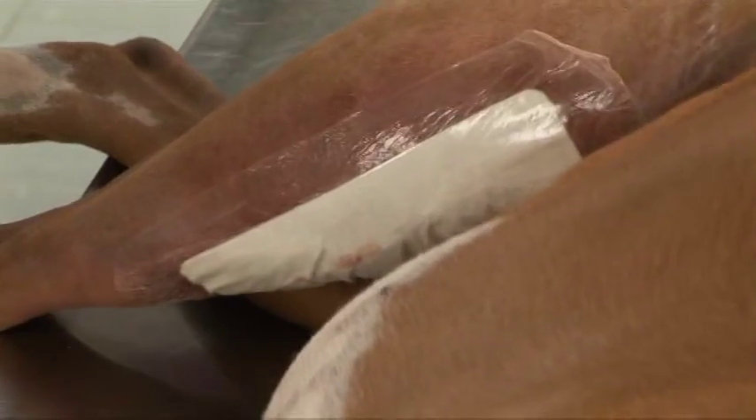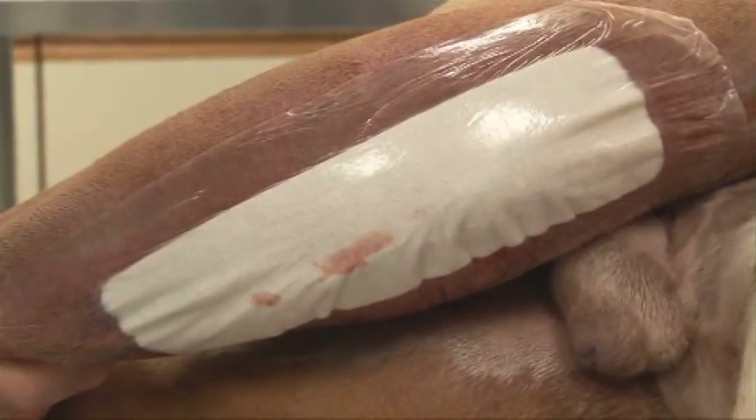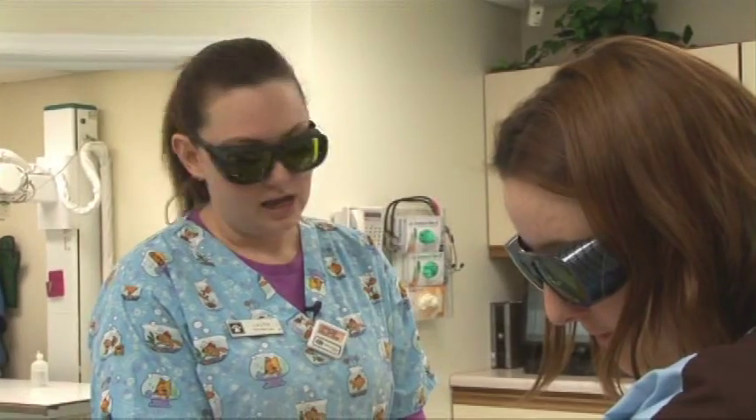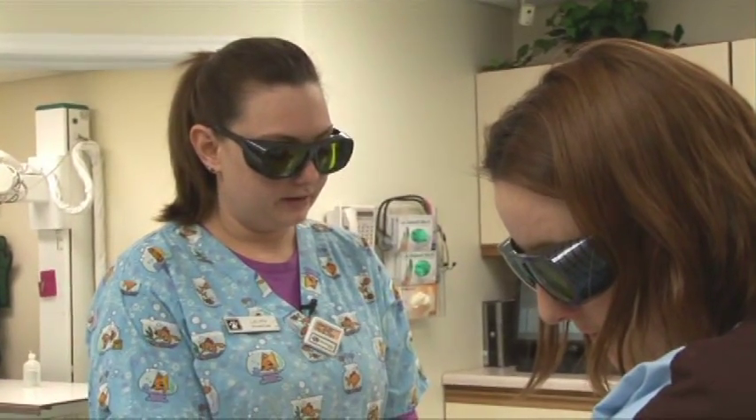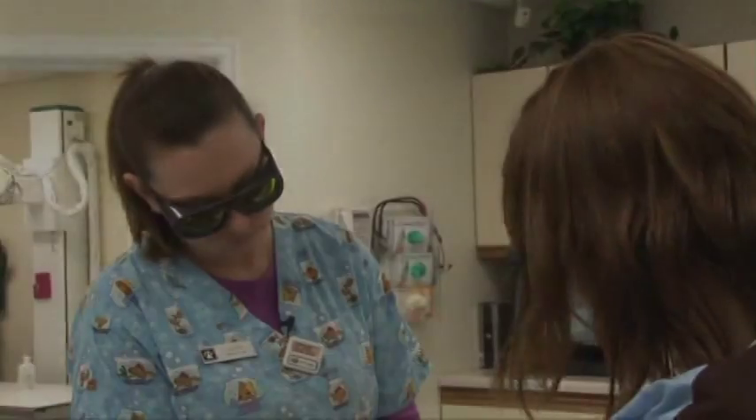If Dr. Ryder thinks that he needs to have some more laser treatments, we will go from there and give him more. It actually makes me feel like I'm making a difference because I do know that it works. I've seen it work on patients and knowing that in the long run it's going to help them, it makes me feel like I'm doing my job better.